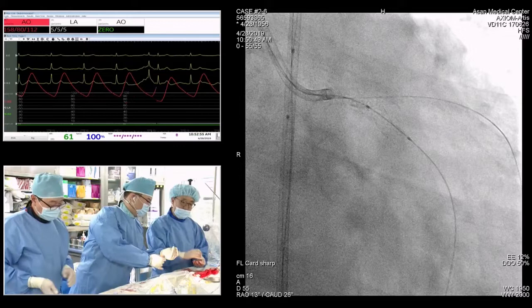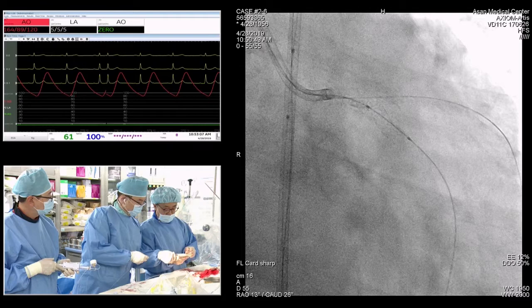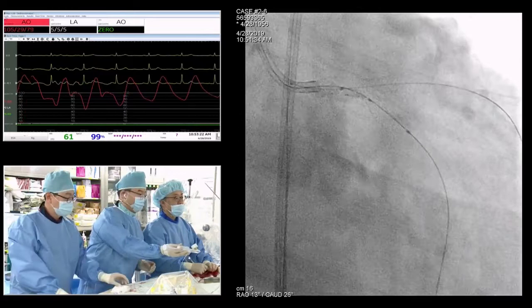Nowadays the emphasis of POT, re-POT and the final re-POT depends on the final IVUS configuration. I decide whether or not to do the final re-POT. This is an additional 4.0. I think that's a fine approach, as long as you guide it by IVUS. Some would just do it routinely and not think about it. It would be important, if you can, to IVUS the circumflex in particular at the end.